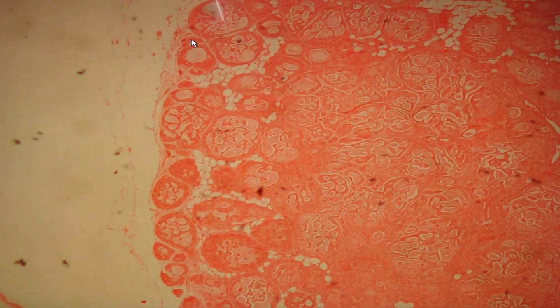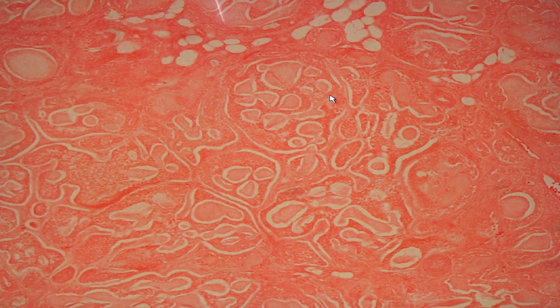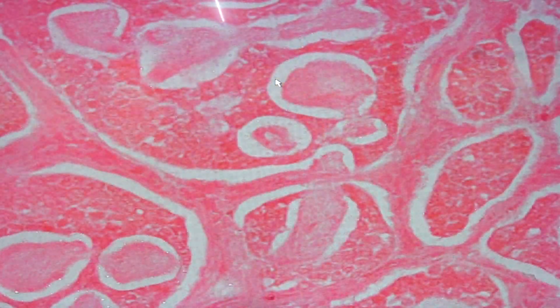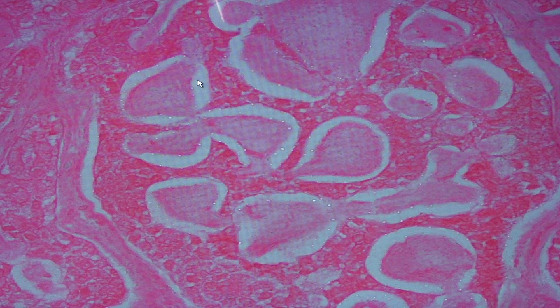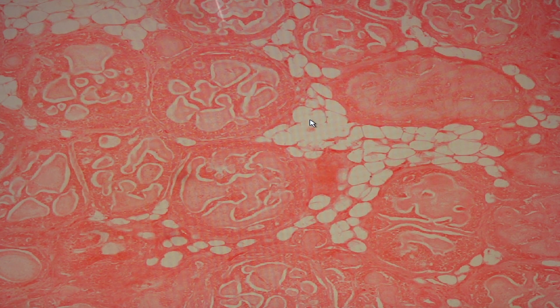Our last slide is slide 222, adenoid cystic carcinoma. Adenoid cystic carcinoma is the second most common malignant tumor of the salivary gland. It is associated with the formation of nests punctuated by spaces containing homogenous pink amorphous material. The cells are small round cells, and the cystic spaces, if tested with PAS stain, would be positive. Those are all the slides for this session — kindly review them.